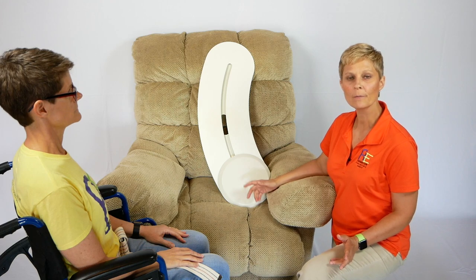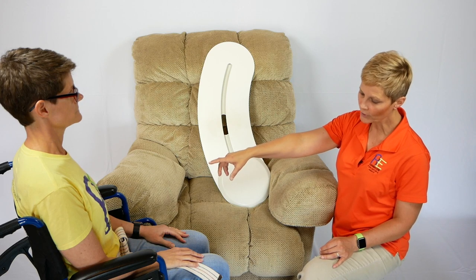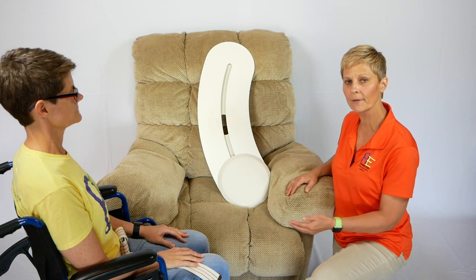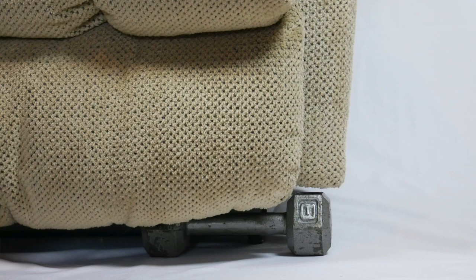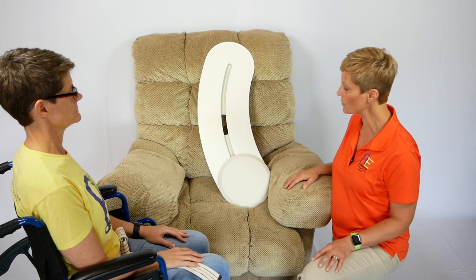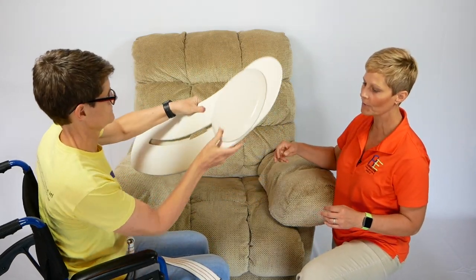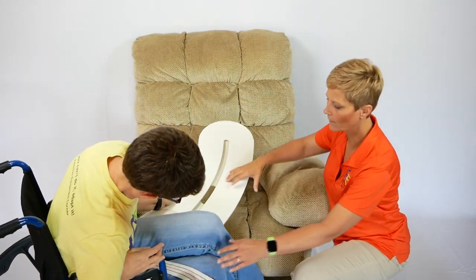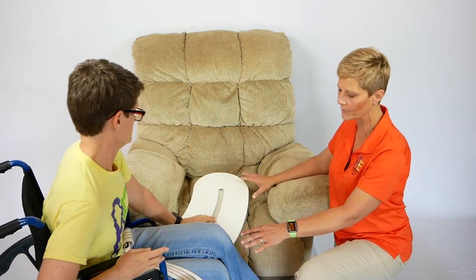Now we're going to demonstrate the BZ Glider transfer from the wheelchair to the recliner without removing the wheelchair arm. When you have a rocker recliner, you may want to put something under the edge to prevent it from rocking — I've used a handheld weight for that. We're going to have Christina take the BZ Glider and slide it underneath her thigh and buttock. I'll be here as standby for safety.